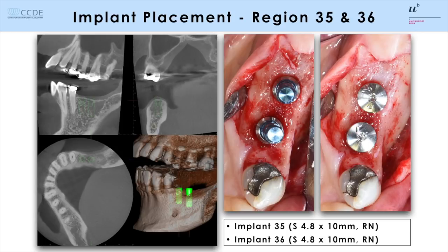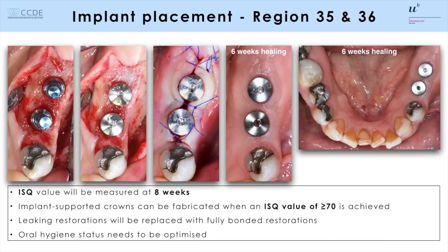You see the intraoral view following the placement of two Straumann tissue level implants in area 35 and 36. This surgical placement allows a non-submerged healing after application of three millimeter healing caps, reducing the need for a reopening procedure following the healing. The anticipated wound healing phase in this case was six weeks and we had an uneventful healing with ISQ values higher than 70.